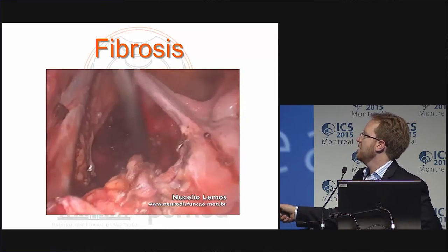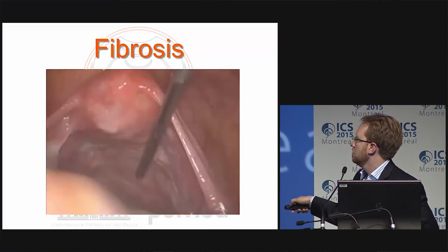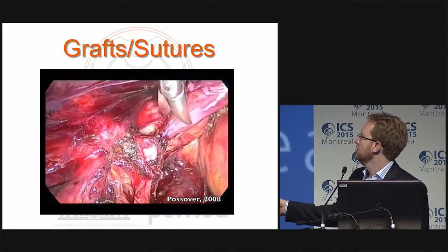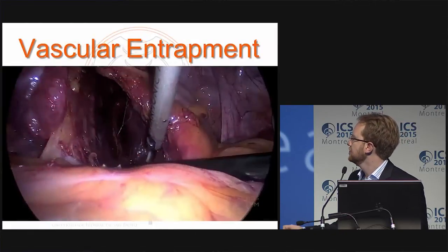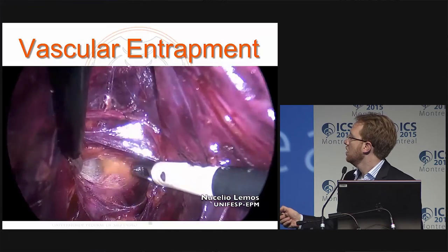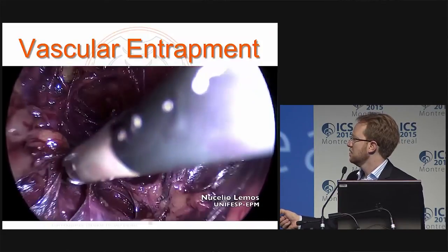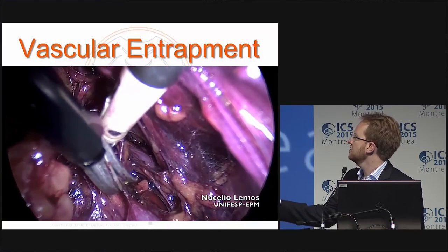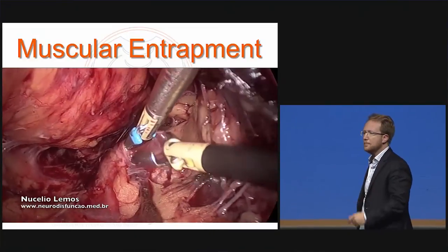Pressuring the scar shows the correlation of the sciatic nerve with the peritoneal surface. This is a McCall suture on S2 — you can see the suture here. We can also have pelvic varicosities: a dilated vein trapping the nerve roots. This is S3, and these are the pelvic splanchnic nerves on the left side.